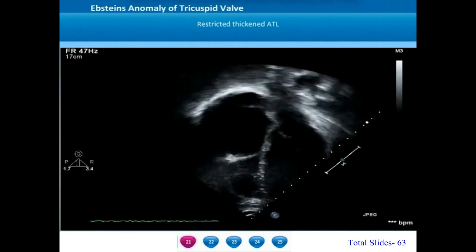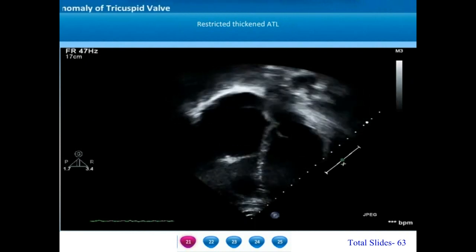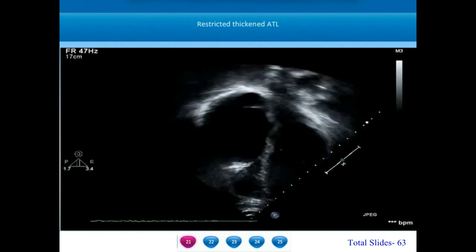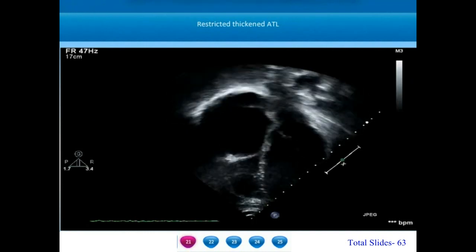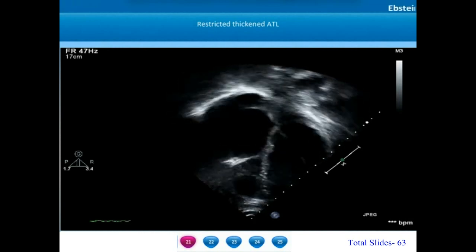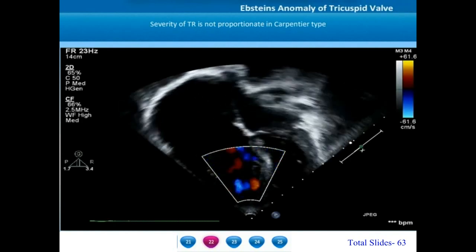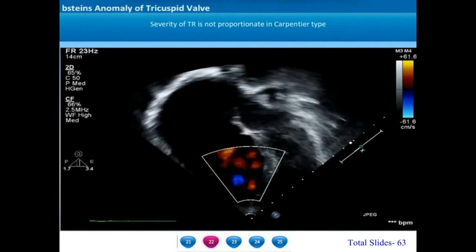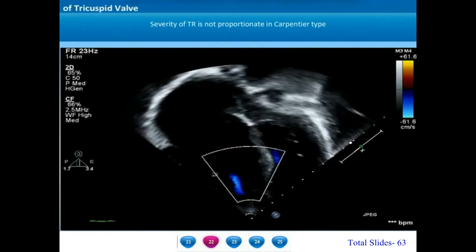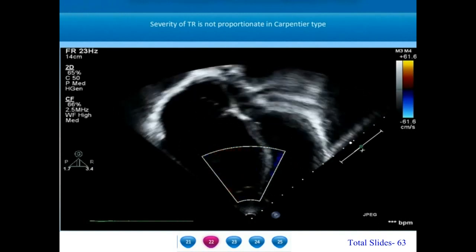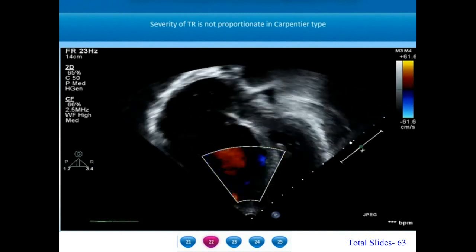When sweeping on a posterior plane, we can appreciate the thickening and dysplasia of the anterior tricuspid leaflet and nodularity of its posterior portions. Carpentier type C Epstein's anomaly is diagnosed whenever the anterior tricuspid leaflet is less mobile and is markedly tethered to the right ventricle. The severity of the tricuspid regurgitation is not proportionate to the Carpentier type.